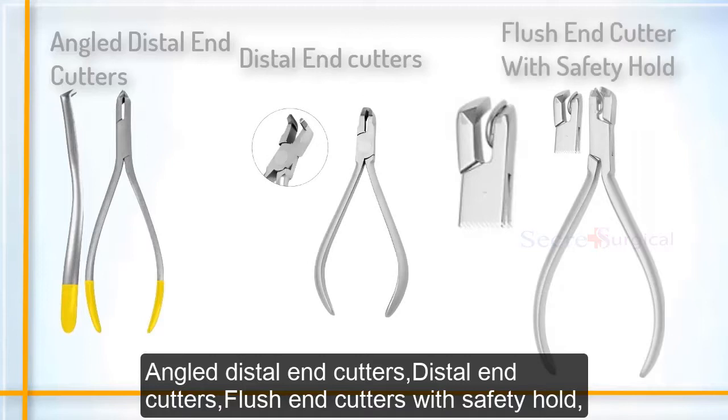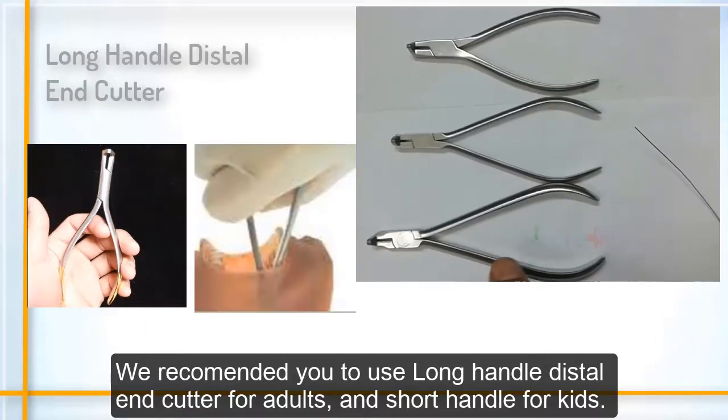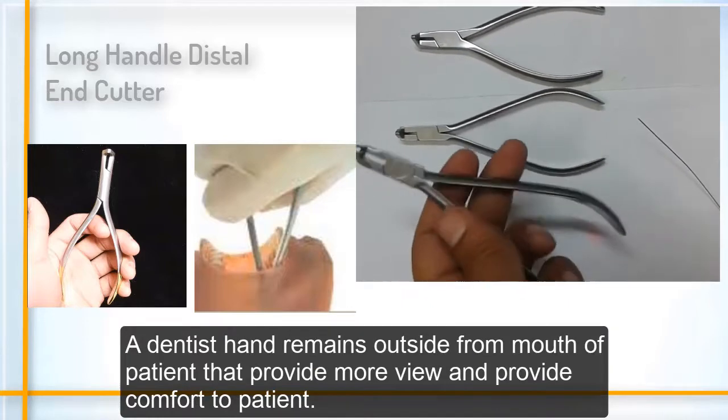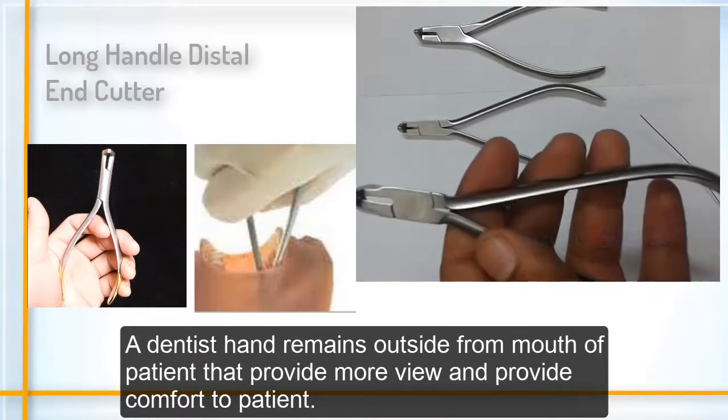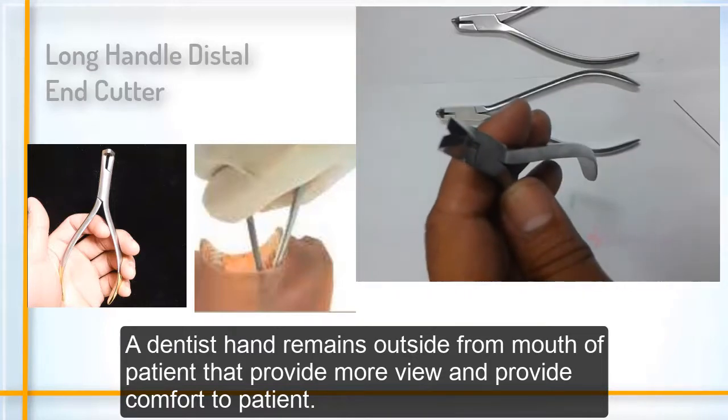We recommend using long handle distal end cutters for adults and short handle for kids. The dentist's hand remains outside the patient's mouth, which provides more view and provides comfort to the patient.